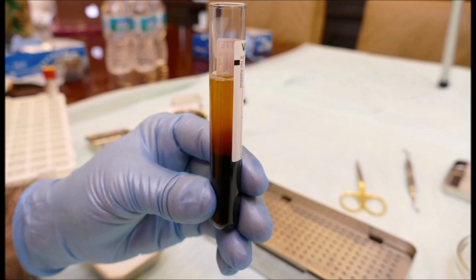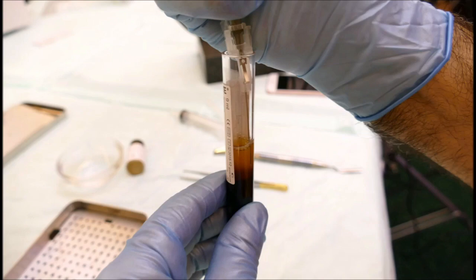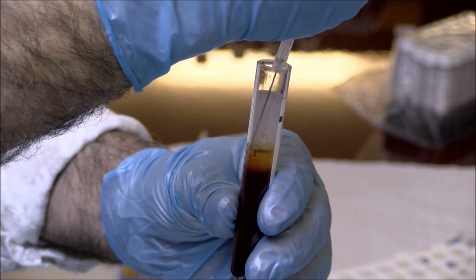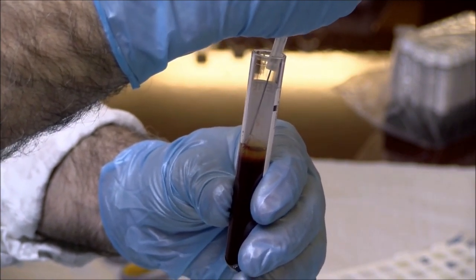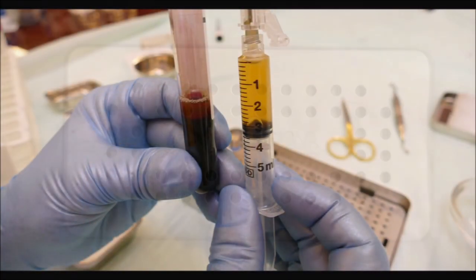The white top tubes are removed after three minutes. A sterile syringe is then placed in the plasma zone, and the plasma is very carefully harvested. The plasma is then set aside while we complete fabrication of the PRF membranes.